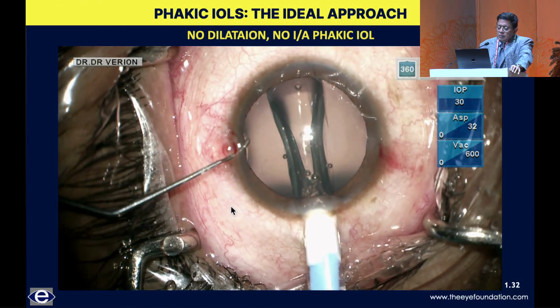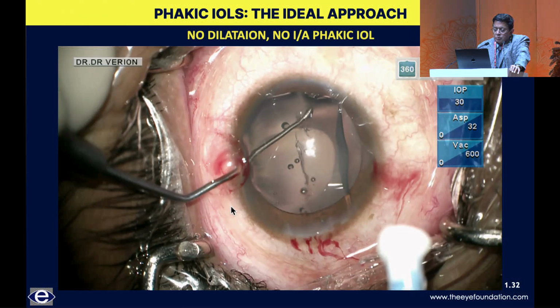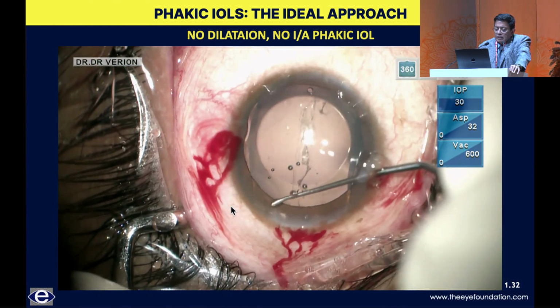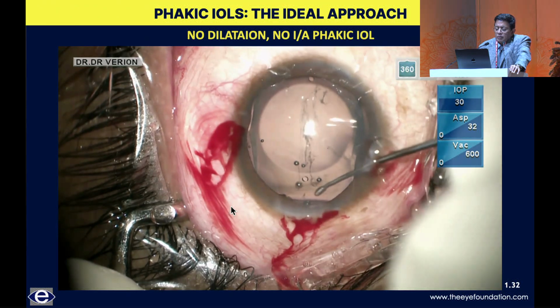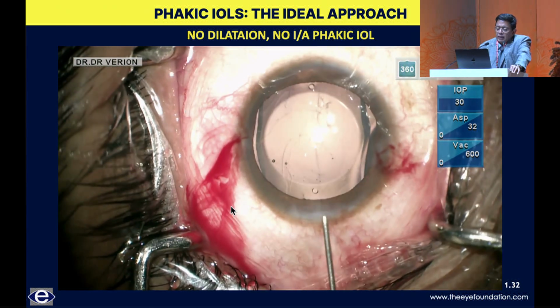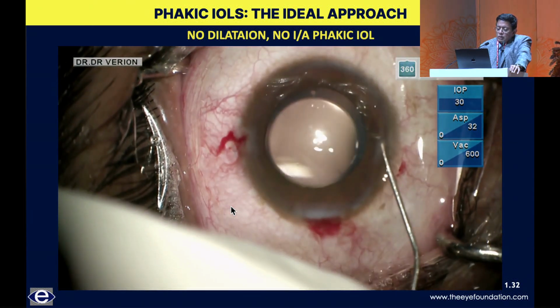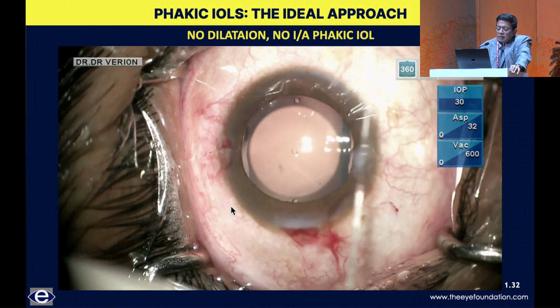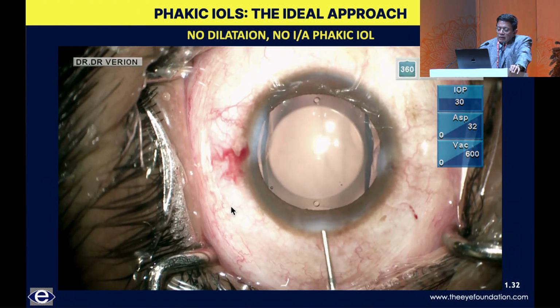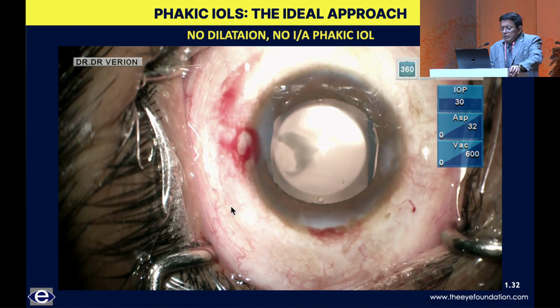This is the lens being implanted, and it's important that you ensure that the leading right optic has the small hole over there. In case you're using the Indian lenses, the indicators are a little different. We'll come to that. These are the lenses being positioned, and this is the only step that you need to learn differently from other anterior segment surgery, where you have to gently tuck the lens from behind. As I'm hydrating the wounds, you can see the cohesive viscoelastic completely flowing out. Once clear fluid starts coming out, I know the viscoelastic is completely drained. There have been questions as to whether there could be viscoelastic captured behind the optic of the lens, but in about 3 years that I've been doing this routinely, this works very well for me.